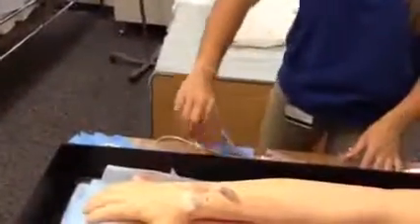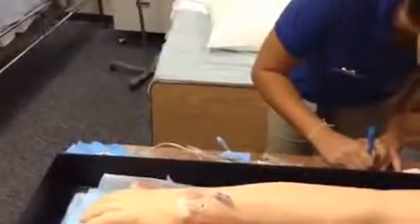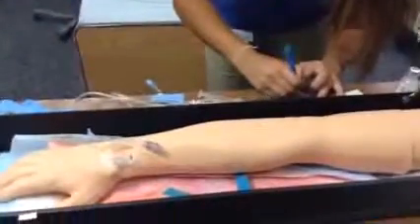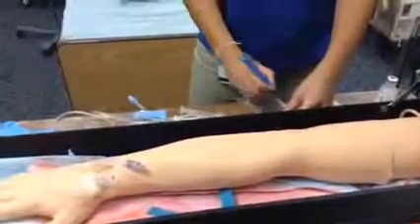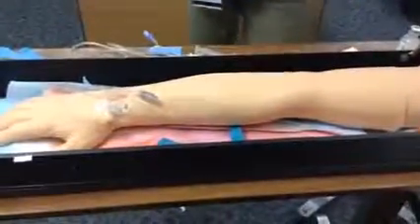Now we're going to label it. We're going to put the name of the patient, so Mr. Smith, the date, the time, my initials, and the dose of the medication. And also we're going to put the drug name of the medication. Alright, and we've got that ready.